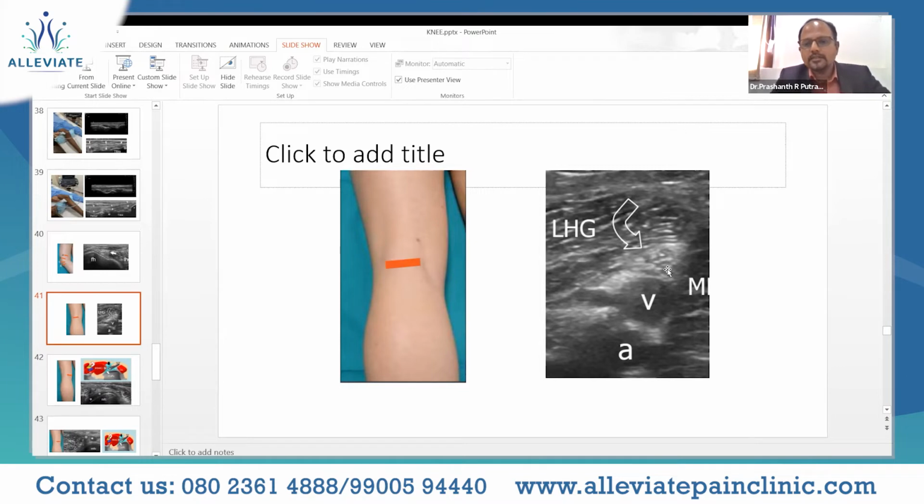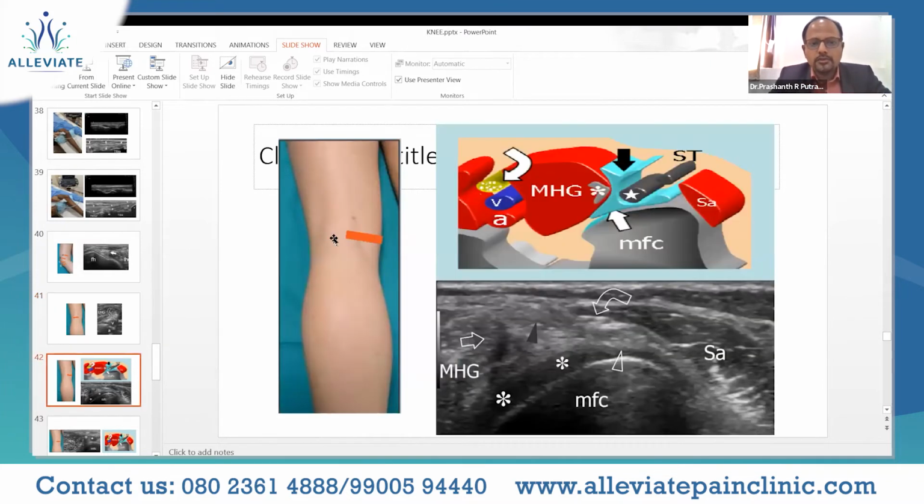So here we would expect only the tibial nerve portion of that, accompanied by the vessel, that is the artery and the vein. All right. So moving a little medial from the earlier position, we would be reaching at the medial aspect.